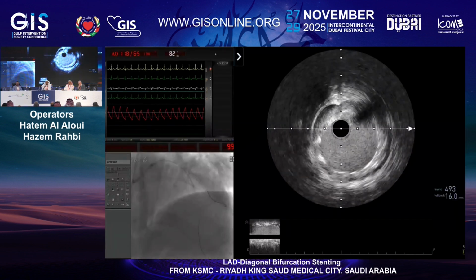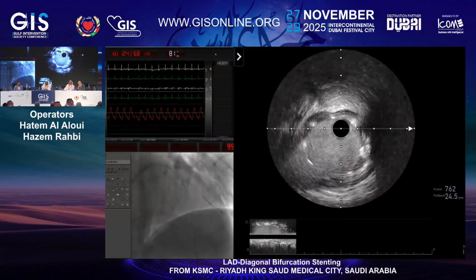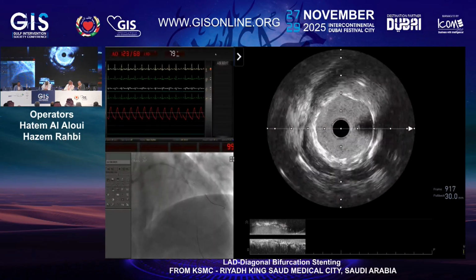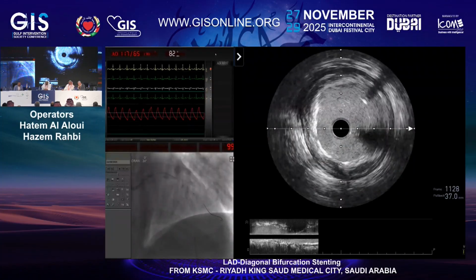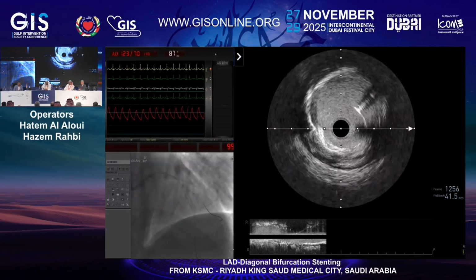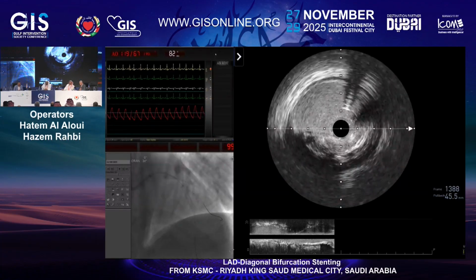Can you see the IVUS, guys? Sorry. Yes, so this is after balloon post-dilatation. Distally, we have no dissection and excellent expansion. The apposition proximally is good. That's the wire of the diagonal, actually not a strut, and that's the proximal lesion. I don't think it's really significant.